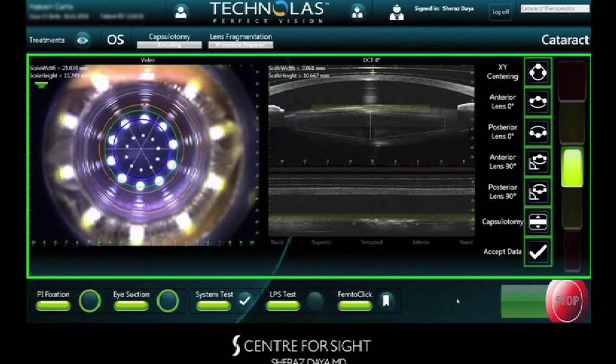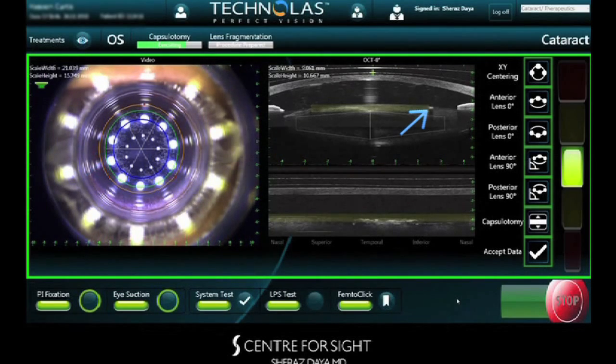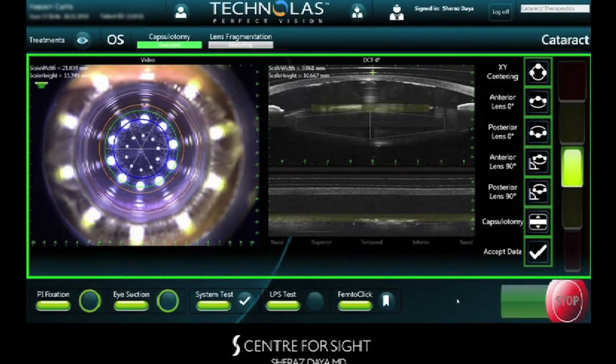Notice the fine gas bubbles at the level of the anterior capsule, as well as resection of the capsule on OCT. Following capsulotomy, lens fragmentation is performed and in this case the lens is divided into six segments. Following successful femtosecond laser surgery, suction is then removed and the patient is transferred to the operating table.